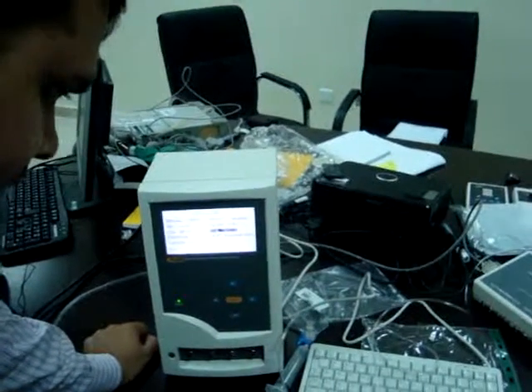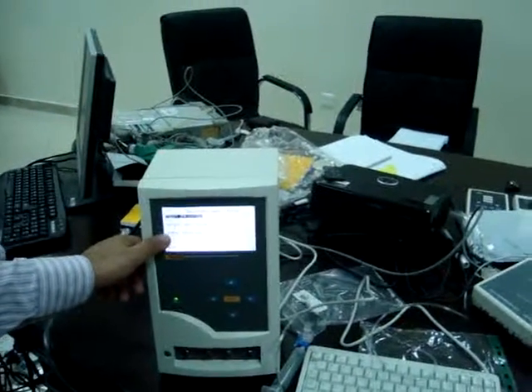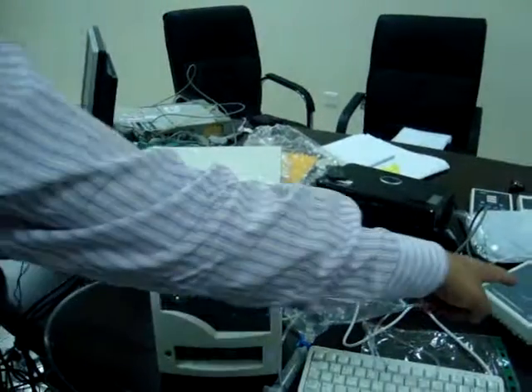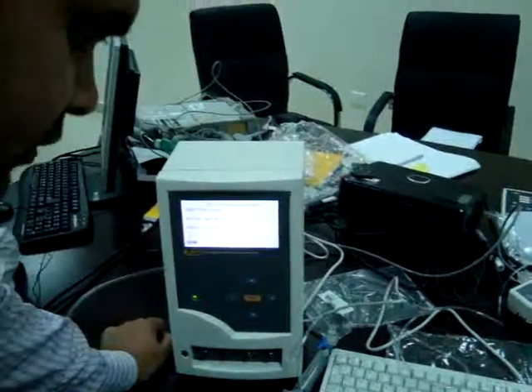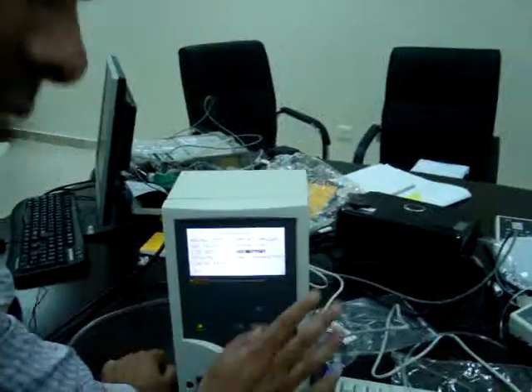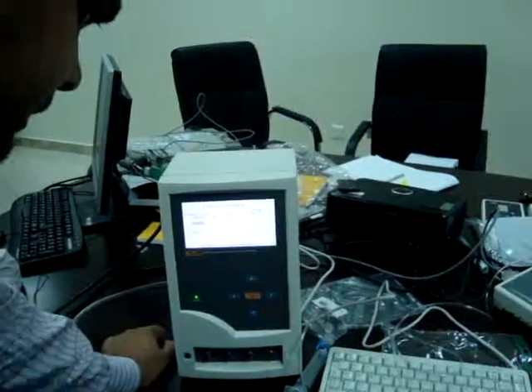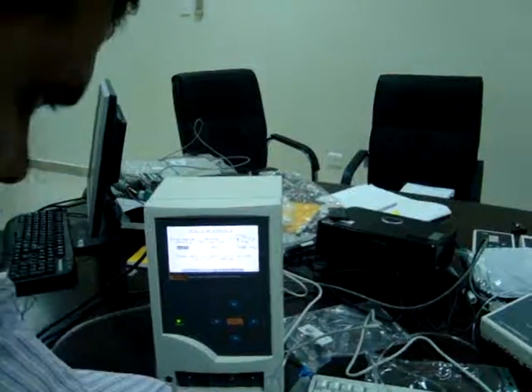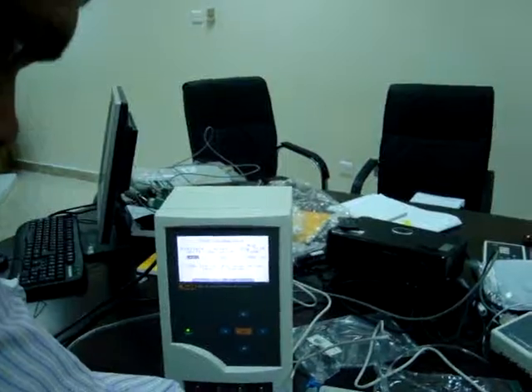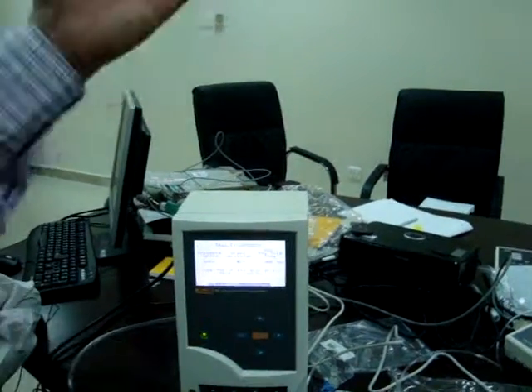Then you can do engineering test parameter, testing the printer, print setting, trigger box. This is called trigger box. Normal users need not go here. Then you can go and set the parameters, what units you want, your pressure in kPa, psi, millimeters of mercury, the graphs deviation.